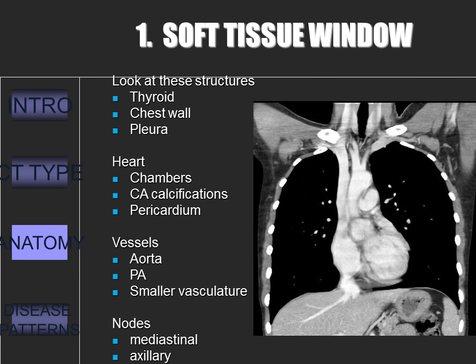The soft tissue windows help evaluate the mediastinal structures, pleural fluid, and calcification. Aerated lung is black, bone and calcium are white, muscle, heart, and large vessels are light gray, and fat is dark gray. It is on this window that you should look for lymph nodes, both axillary and mediastinal. Also, remember to look at the coronal as well as the axial views — it's like a double check verification mechanism. Use whatever images you can.